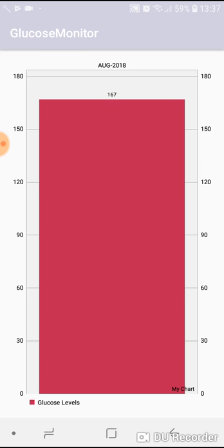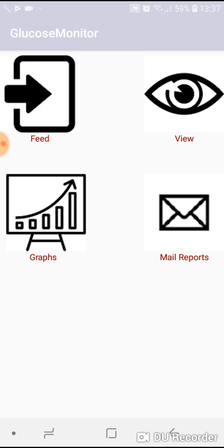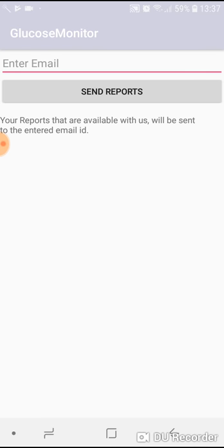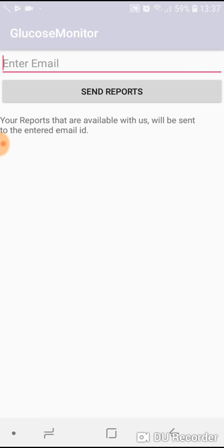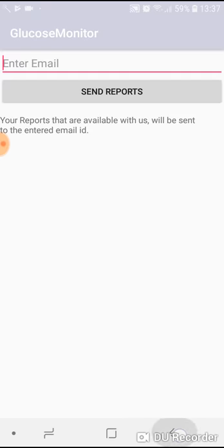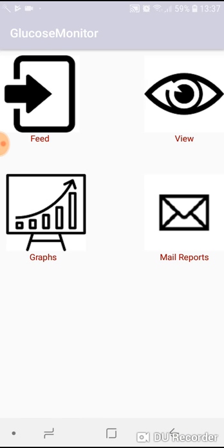Mail reports - in this field you can enter anyone's mail ID, be it your parents, your children, or anyone, or your doctor. Just enter the mail ID and press the send reports button. The report will be sent over the mail in CSV format.